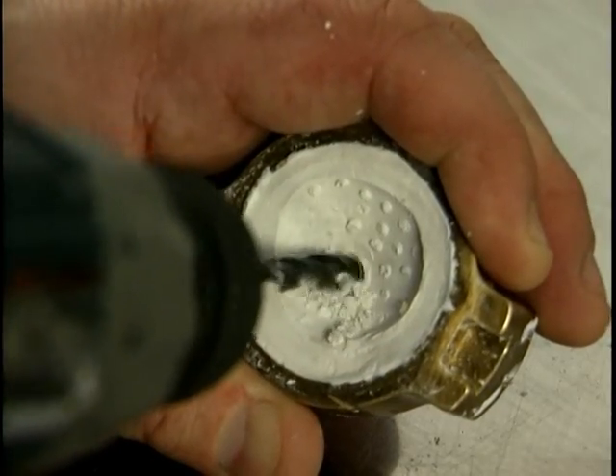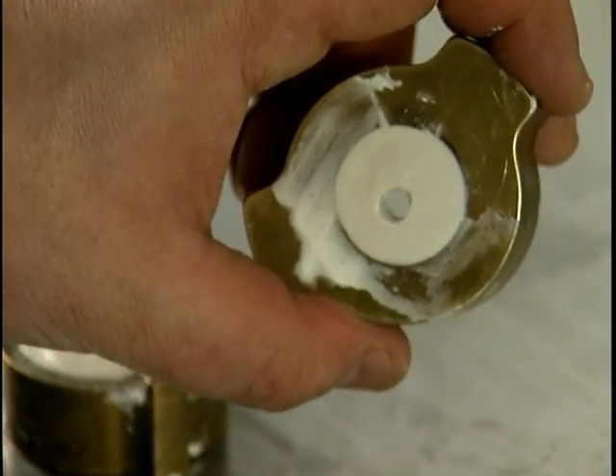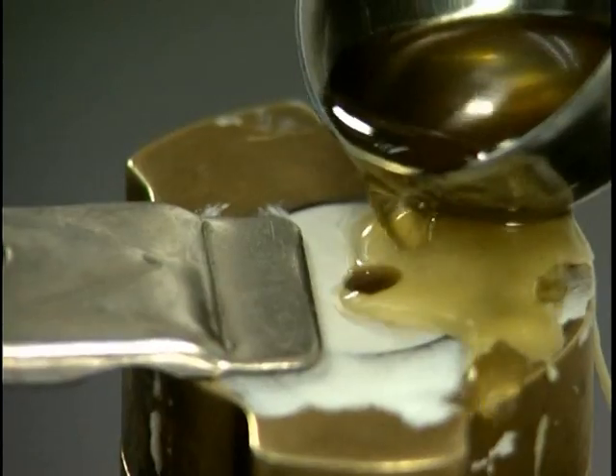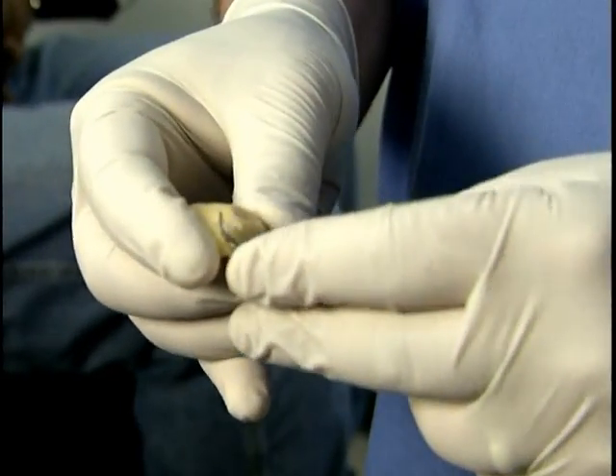Before wax pouring, drill a hole into the highest point of the interior side. Release the surface of the mold and heat the ocularist wax. Clamp the mold and pour the wax. After the wax cools, separate the mold and carve away any surface imperfections.